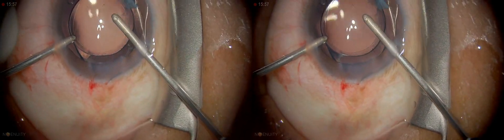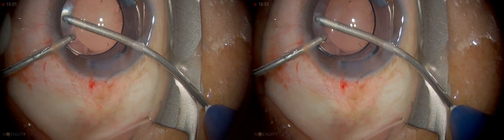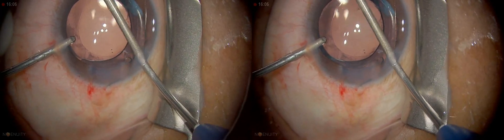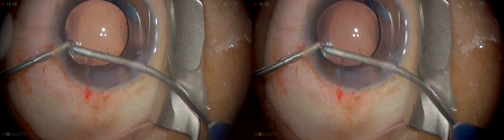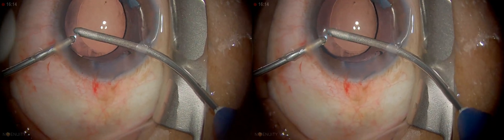Take the viscoelastic out — going under the lip and trying to clean up a little bit on this side. So the anterior capsule — it's not a step that a lot of people do, but I like to do this routinely. I clean up a little bit, or as much as possible.